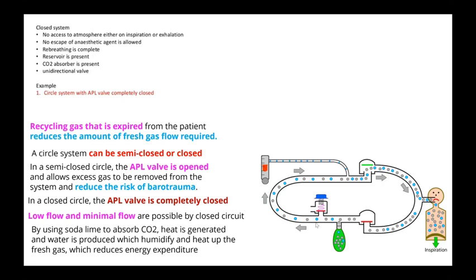And of course, all of you should be familiar with that, because these are commonly used circuits nowadays for any case. Tonsillectomies nowadays we are doing under controlled ventilation. So all of you should be familiar with that.